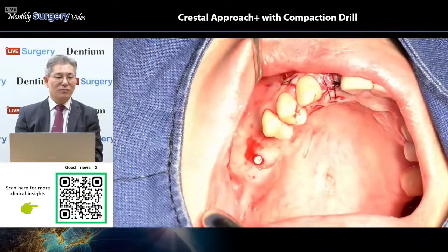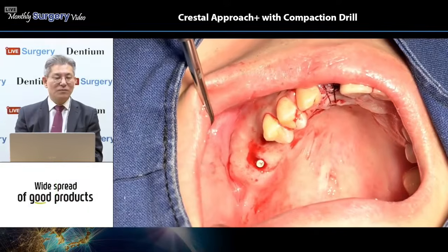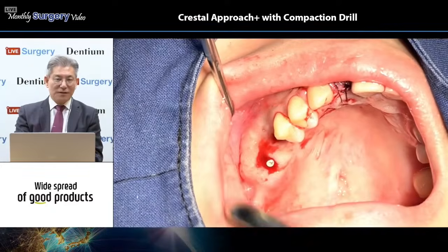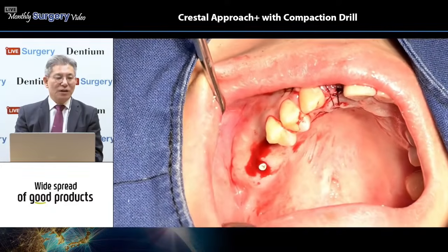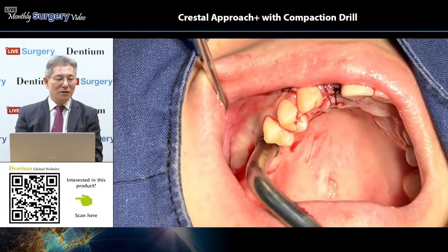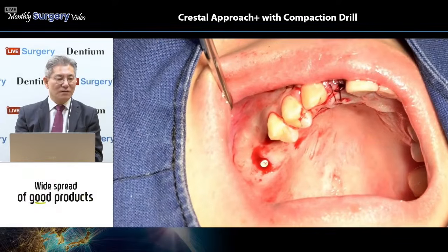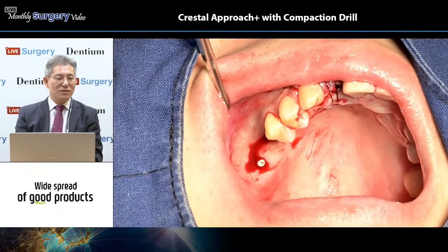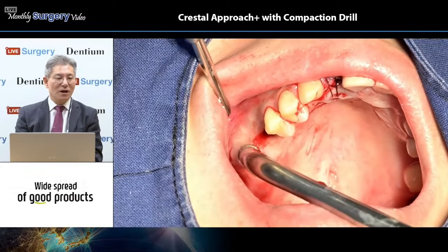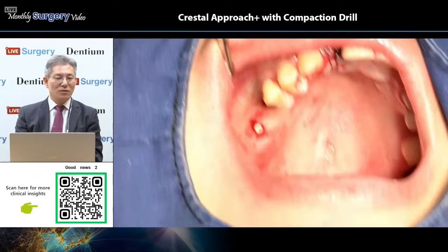This Lindemann drill prevents slipping on an inclined surface of the bone, and gives exactly the correct point drilling. Actually, the Lindemann type final drill gives us efficiency, favor and good advantages. So, if possible, you may use this Lindemann type final drill when you have hard bone at the osteotomy site.